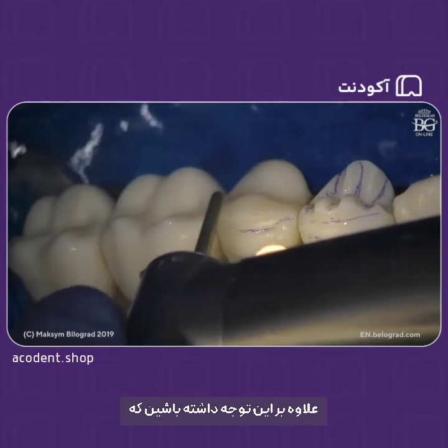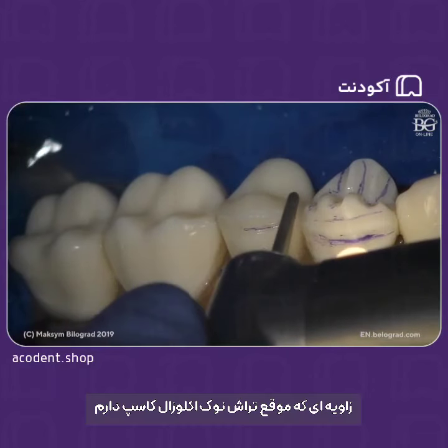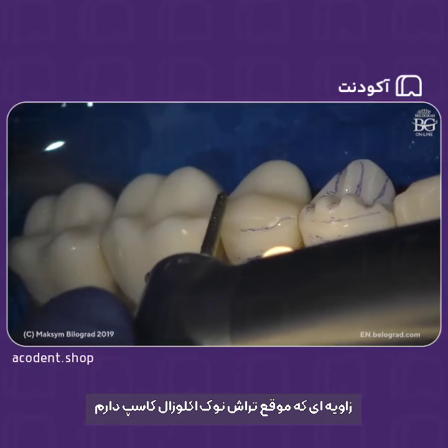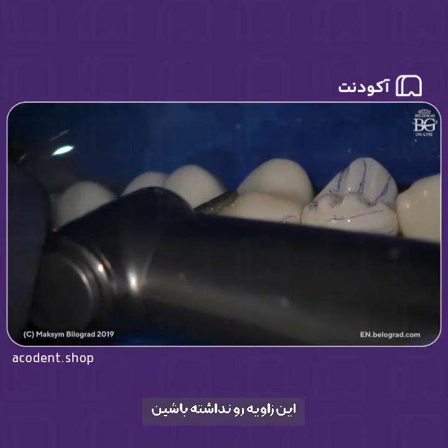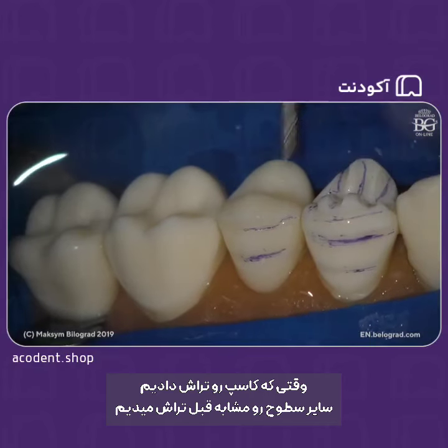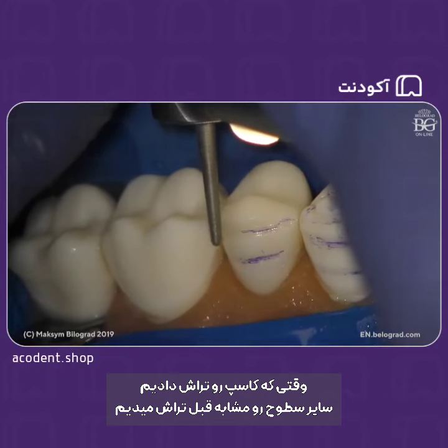Also note the angle that I'm using now when I'm preparing the occlusal tip of the cusp. I have slight buccal angulation. Don't do this angle. We do this angle, okay? Once we have our cusp prepped, we will continue with planes, same as we did for the molar tooth.